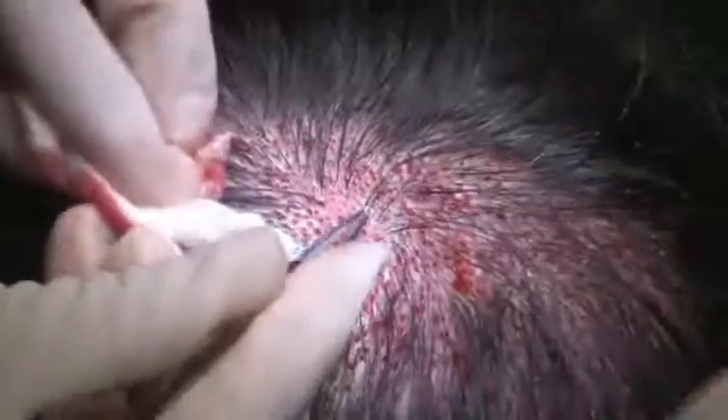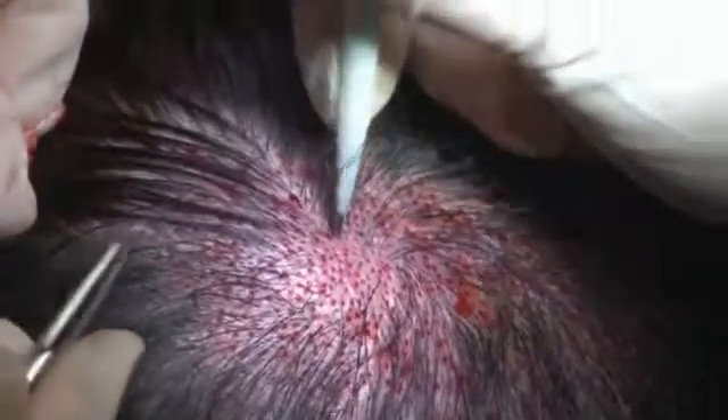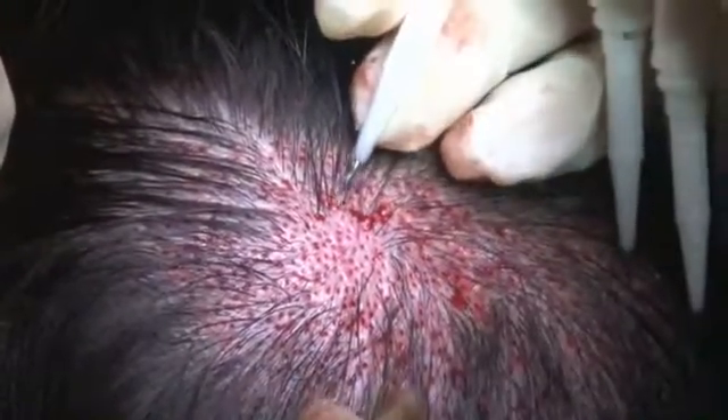I transplant only 3 hair follicles to the whorl to increase hair volume and obtain a camouflage effect. I rotate the implanter after insertion into the skin to get the same curvature as that of the adjacent hair.